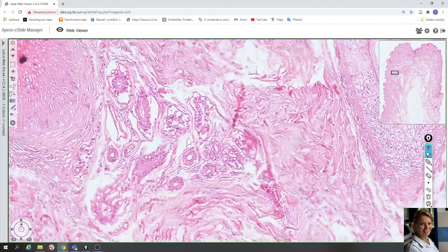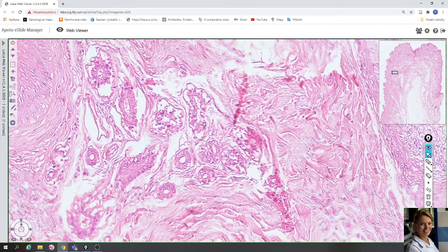the eccrine sweat glands. This is also a tubular coiled gland like the apocrine sweat glands, but the eccrine sweat gland is smaller, and you can see the cuboidal shaped cells which line the eccrine sweat glands.